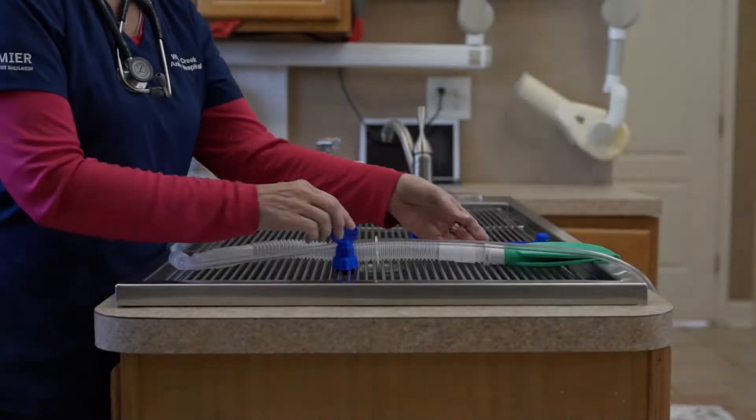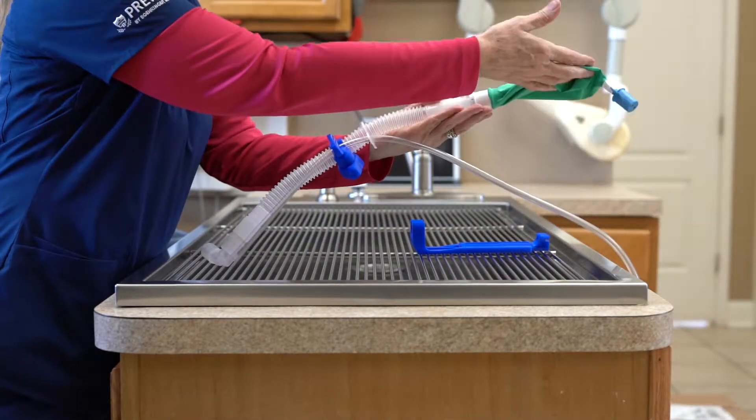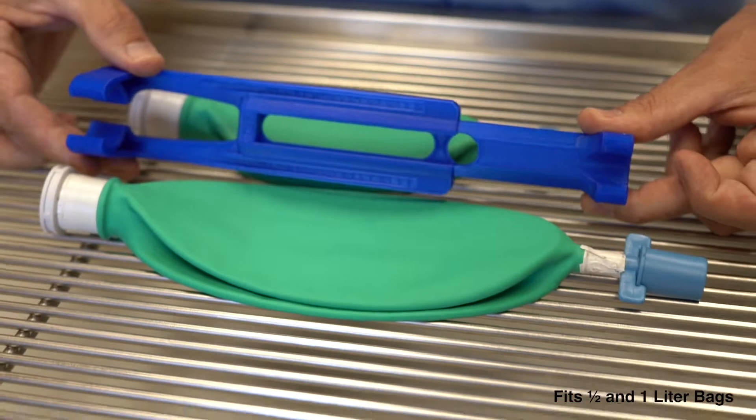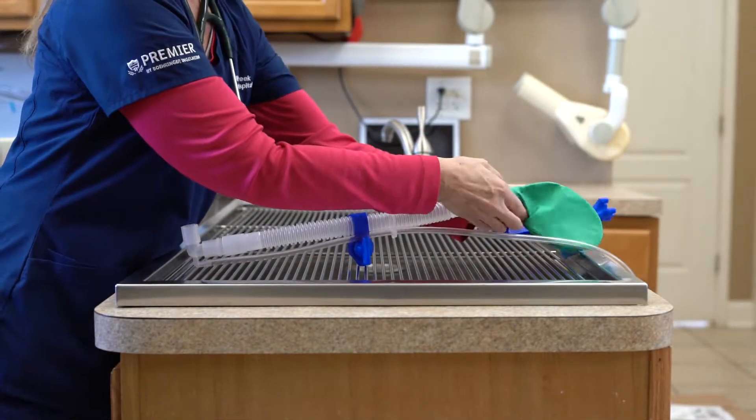Introducing Schaller Industries Non-rebreather Support Kit. This elegant design supports the anesthesia bag and prevents respiratory disruption due to bag pinching. Whether hanging off or resting on the dental table, respiration is clearly visible with the bag supported in the cradle.